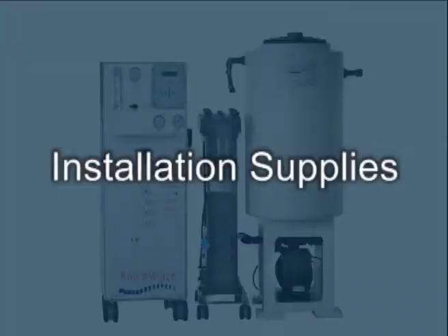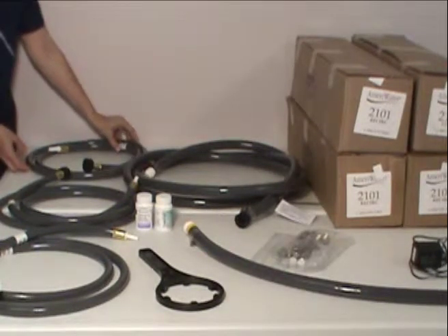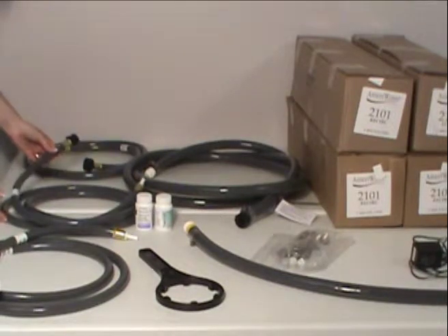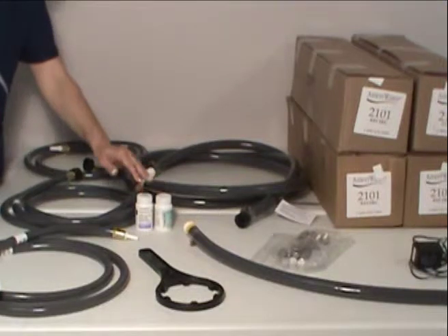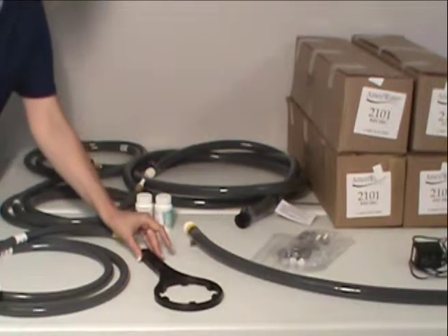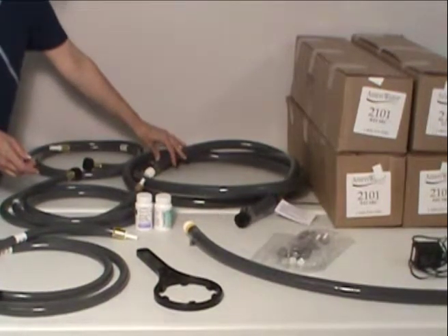Before you begin the installation, it's best to examine your tools and installation supplies. The system includes an incoming tap water hose to the RO system, the product water hose for the RO system, the reject hose for the RO system, the test strips for checking chlorine and hardness levels on the RO system, the wrench to remove the sumps on the pre-filters on the RO system, and a hose used to bypass the entire system if necessary.